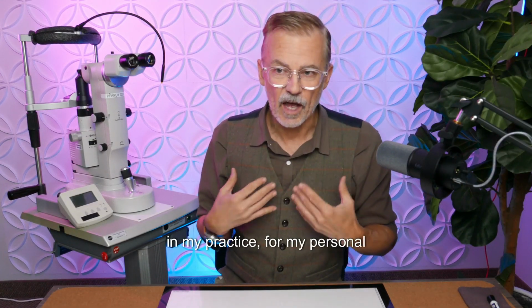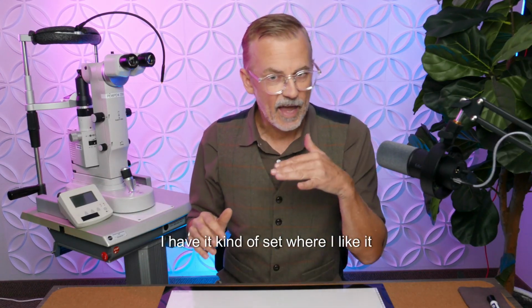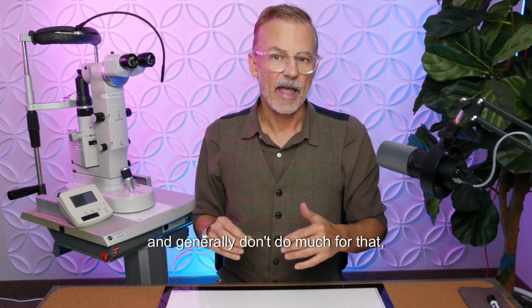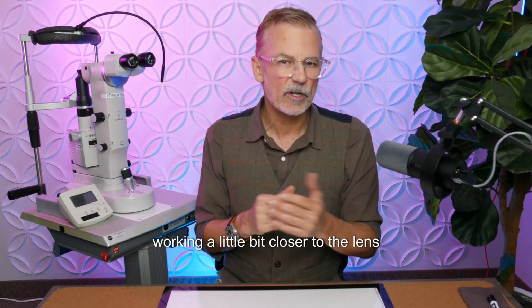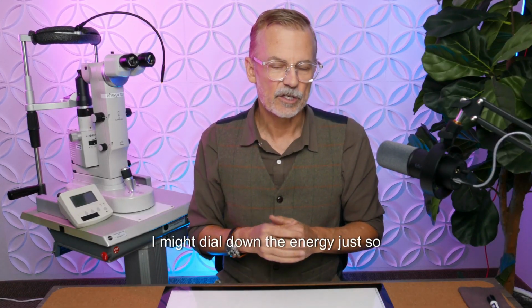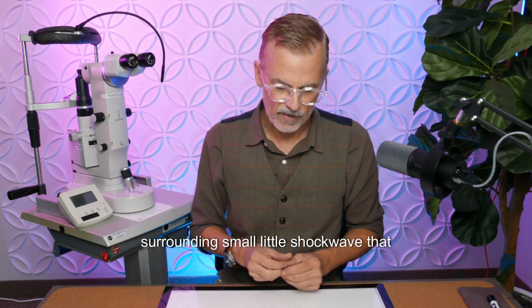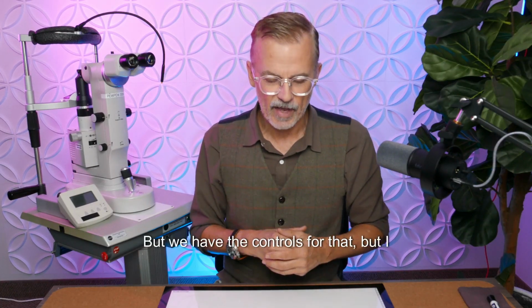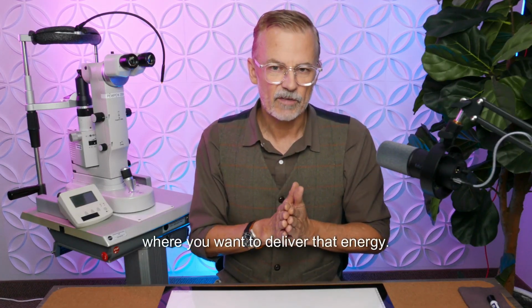In my practice, for my personal preference, I generally don't dial the energy up or down. I have it set where I like it. Maybe in the instance where I'm working a little closer to the lens and getting uncomfortable, I might dial down the energy just so there's a little less of the small shock wave that surrounds that focal point. We have the controls for that, but I don't use that very much.